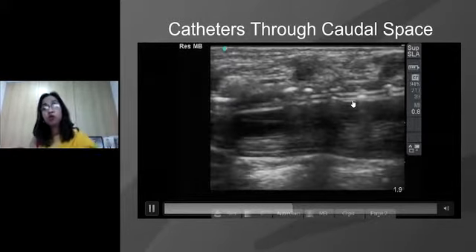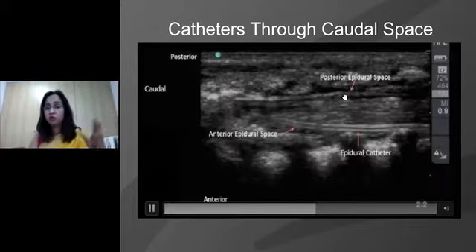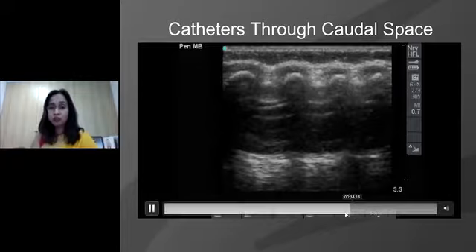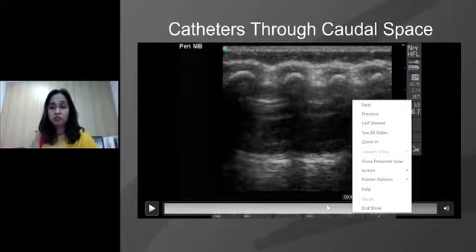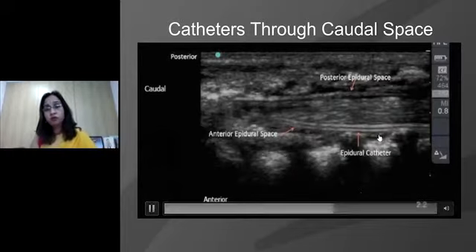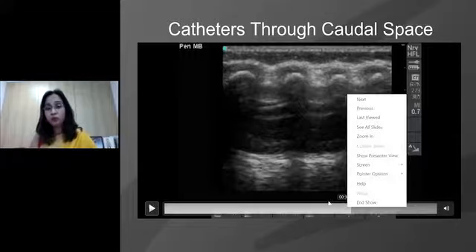I'm showing you different age groups here, in fact. So at 3 to 4 months, the conduit is open for us to see all that we want to see. Sometimes, to our surprise, you can actually see it in the anterior epidural space as well. I'm trying to reverse the video a bit for you to ponder on this particular aspect. So the catheters do walk in the anterior aspect as well.